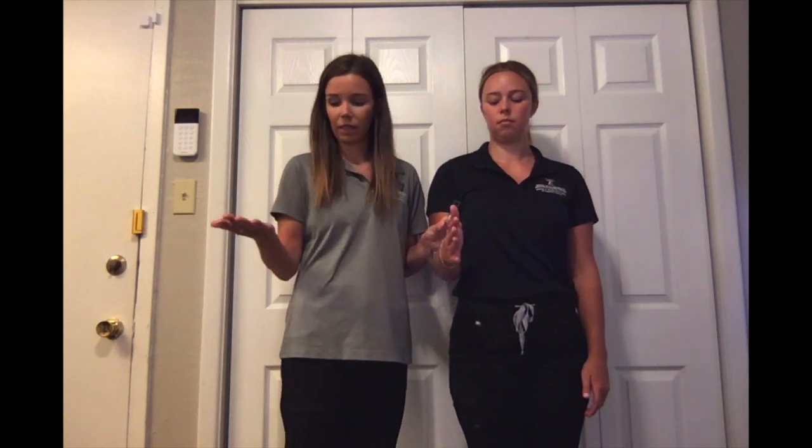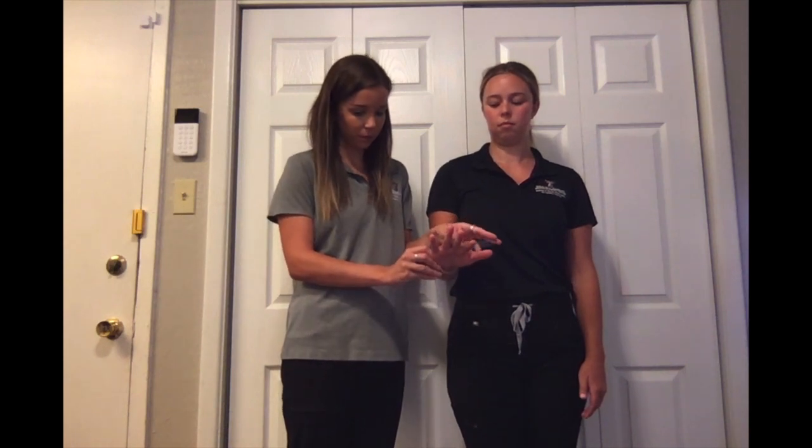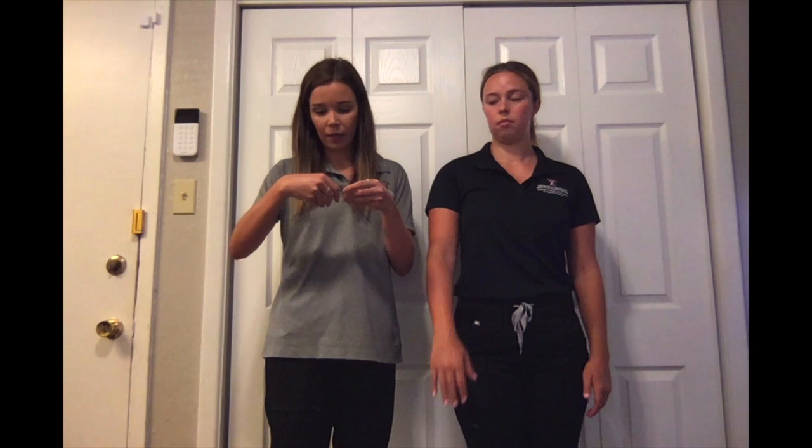Addison, I want you to flip your palm over for me. Addison has 90 degrees of forearm pronation. The norm for forearm pronation is 80 to 90 degrees.